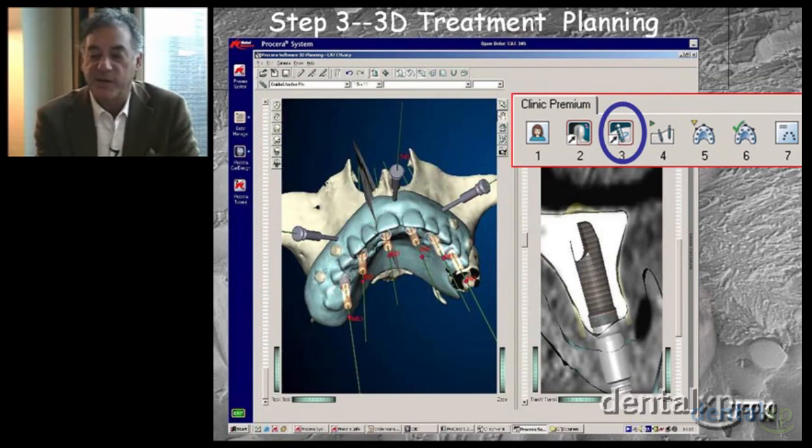You can see the sinus area, and you can see the buccal contour. So an appropriate length implant is positioned on a 2-dimensional screen. In the middle, there is a toolbar that goes up and down, which will allow for the track, if you will, to position the implant sites at different areas of the teeth. And that just rotates right around the arch, allowing us to position the implants in an ideal way.